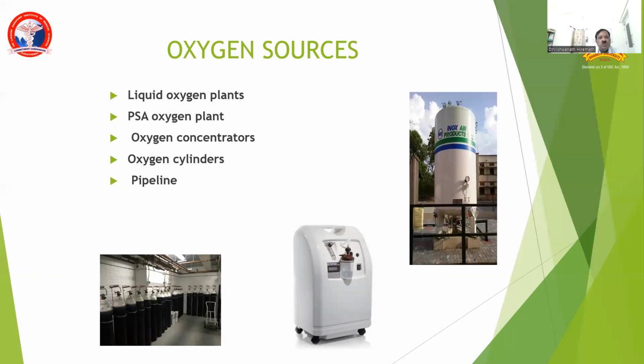What are the different sources of oxygen? Oxygen can come from the cylinders, central manifold, or from the smaller portable cylinders.